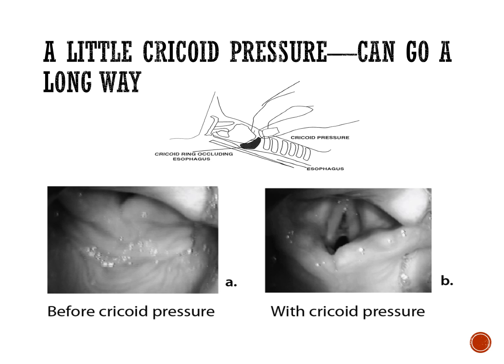And then the lower portion is showing you the same airway, A before the cricoid pressure, and then B, the one on the right-hand side after the cricoid pressure, and you're much better able to visualize that glottis. We wish they were all like that, that the Sellick maneuver or cricoid was this transformational. In some cases it is. Not always, but in some cases it is. Another case of using another strategy to yours and the patient's advantage.